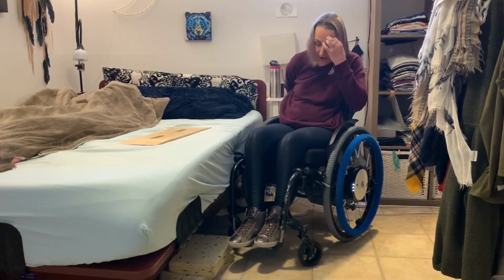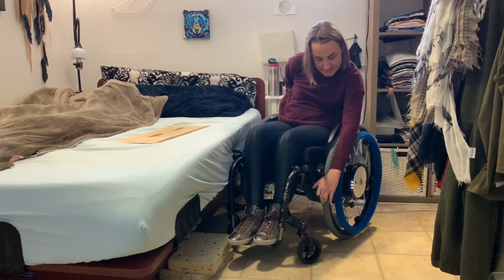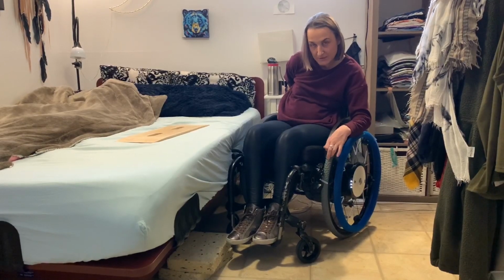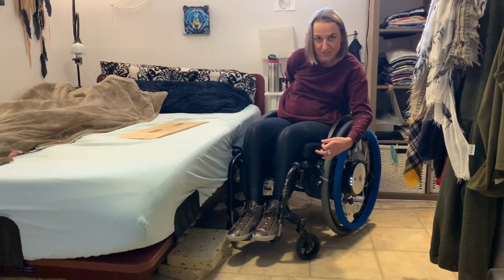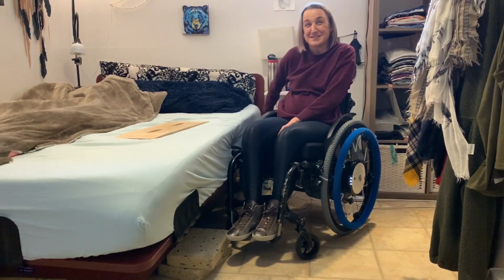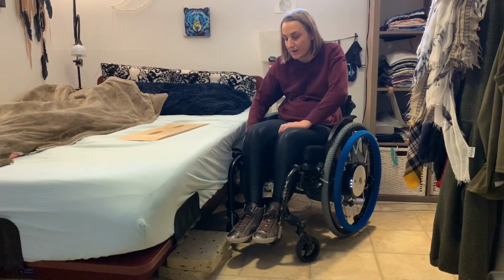On my chair, I also have a little lever underneath that I put down to prevent my wheels from rolling backwards. Sometimes when the brakes get loose, my chair starts to roll off when I try to transfer, and I've fallen before. So anyways, this is what I do now. So we're transferring with a board or without a board.